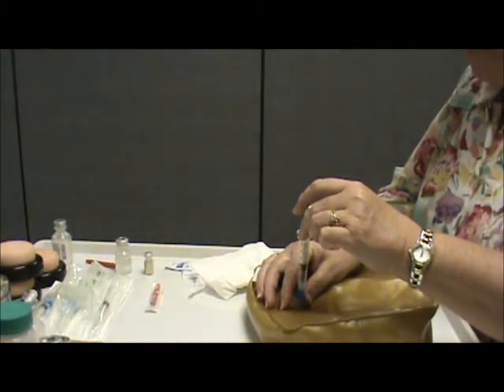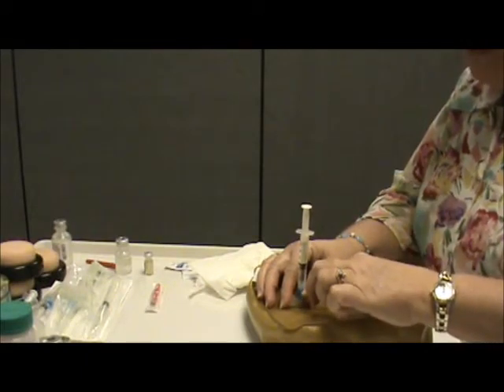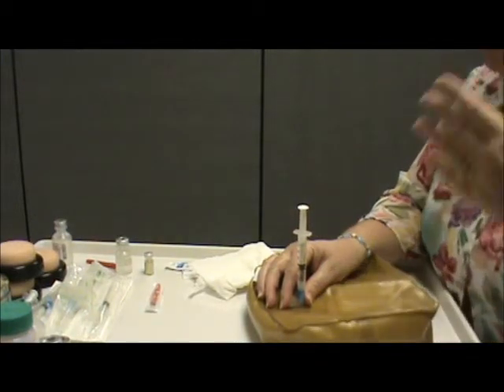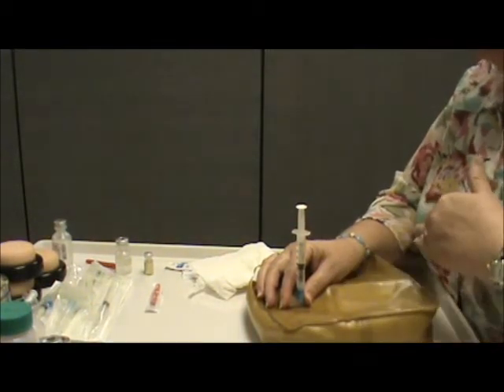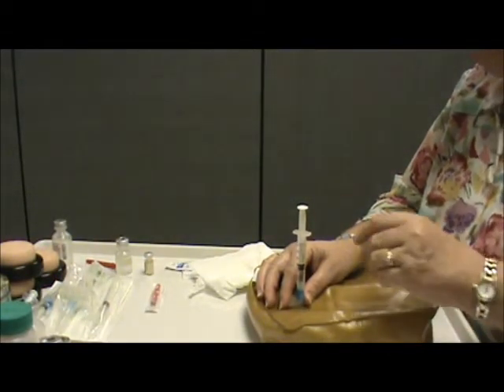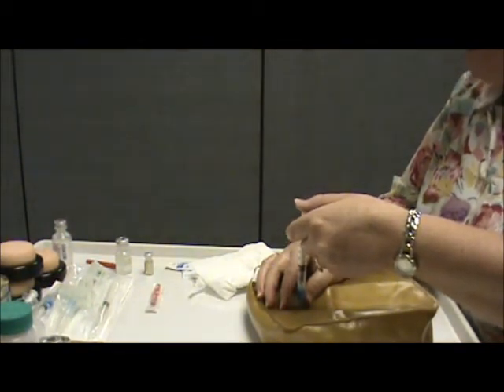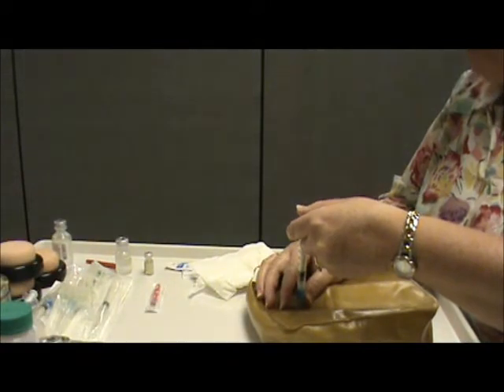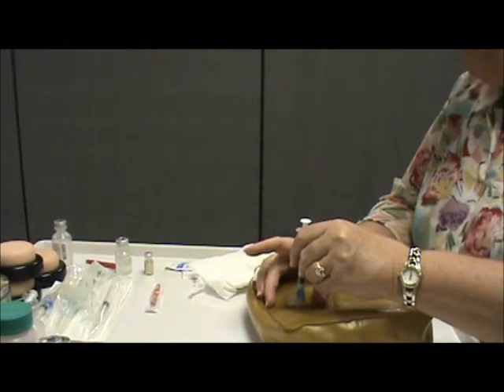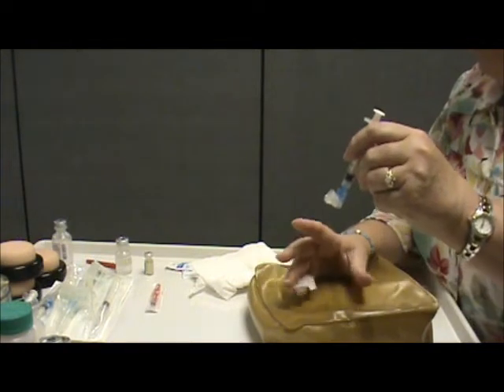aspirate. You'll aspirate a tenth or two, and you'll feel resistance. You're looking down here for blood to come up in there. If you did, certainly you'd have to remove it, take it out, start all over. The muscle is vascular, and so there is a risk of going into a vessel. So once I've aspirated, then I'm going to inject at kind of a slow rate. Done. Okay, wait a second. Allow the medication to absorb into the tissue for a second there, and cover.